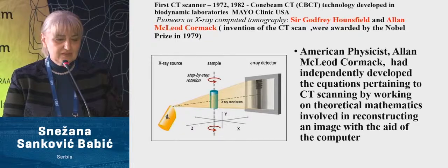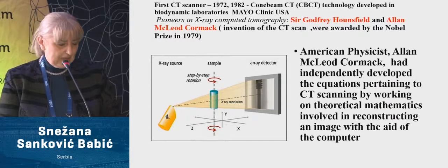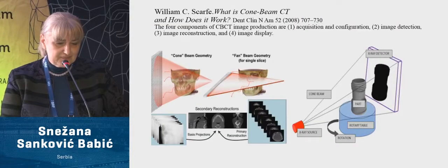First of all, let us remind that the first CT scanner was introduced in medical practice in 1972. Ten years later, CBCT technology was developed in biodynamic laboratories at the Mayo Clinic in the USA. The invention of the CT was awarded the Nobel Prize in 1979 to Sir Godfrey Hounsfield and physicist Allan MacLeod Cormack. American physicist Cormack developed the mathematical equation which enables us to see the reconstruction of the image on the computer screen.